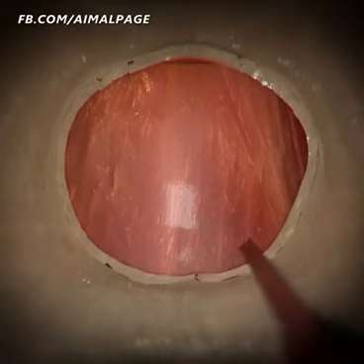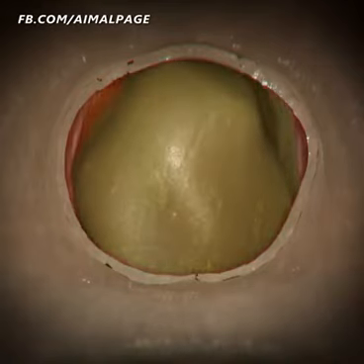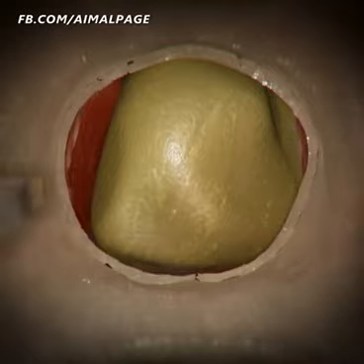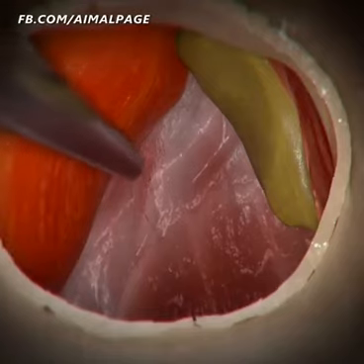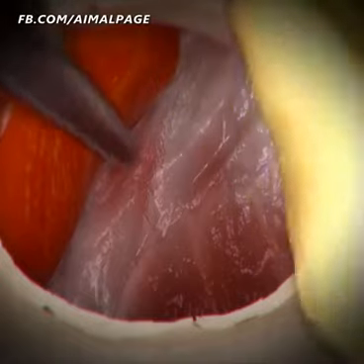The dura is then opened and lifted upward, revealing the pituitary tumor and compressed gland. For large tumors such as the one shown here, the lower portion is removed first using microinstruments and suction. The remaining tumor is separated from the surrounding normal structures, most importantly the compressed pituitary gland, to help preserve or restore its function.